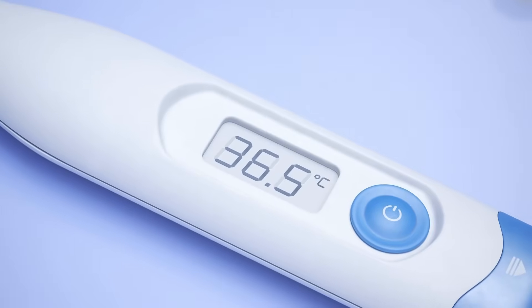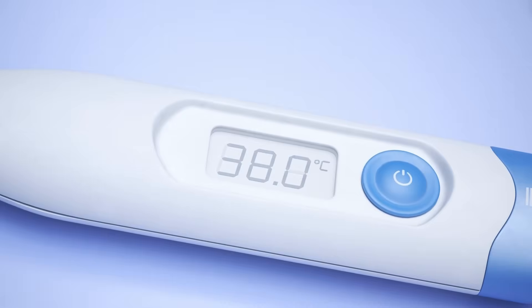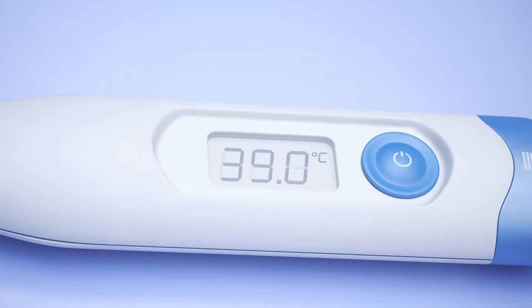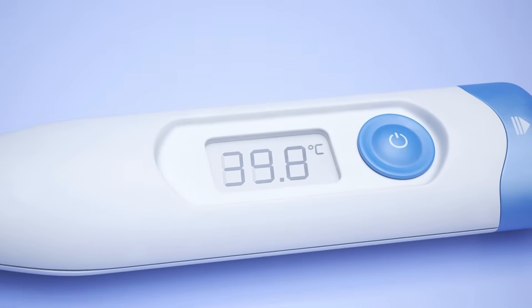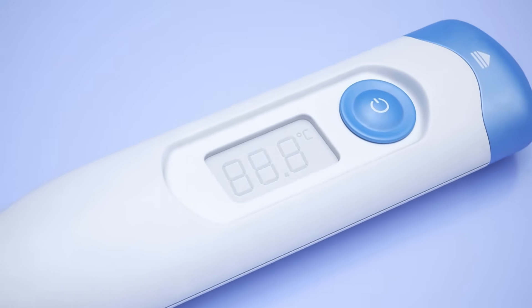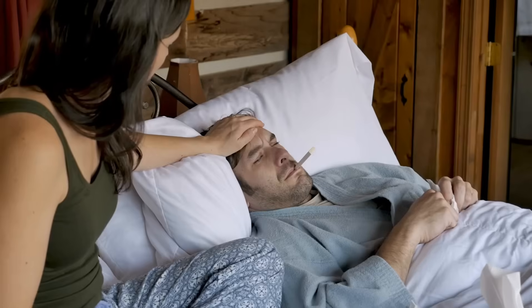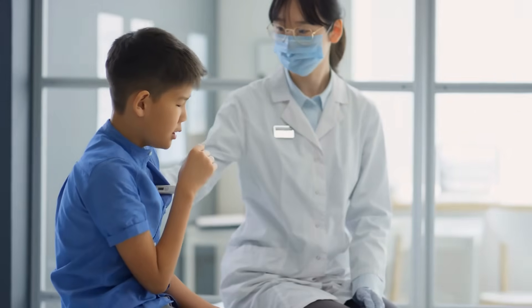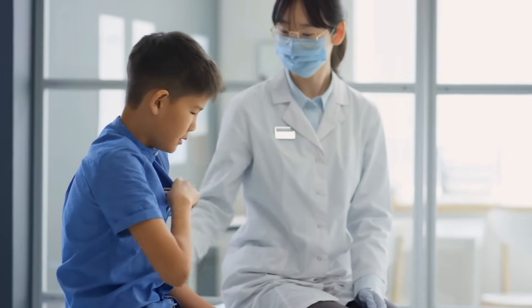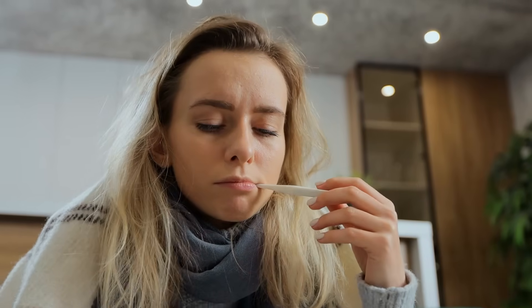So, how does a digital thermometer work? It all comes down to a tiny sensor that detects temperature, a microcontroller that processes the data, and a display that shows the result — all powered by a small battery. It's simple, elegant, and effective. From home use to hospitals, digital thermometers have become an essential part of healthcare because they're safe, fast, and reliable. Next time you use one, you'll know exactly what's happening behind that little screen.